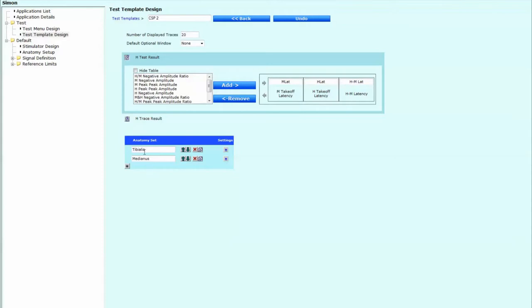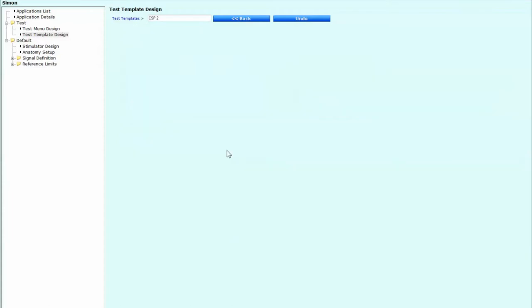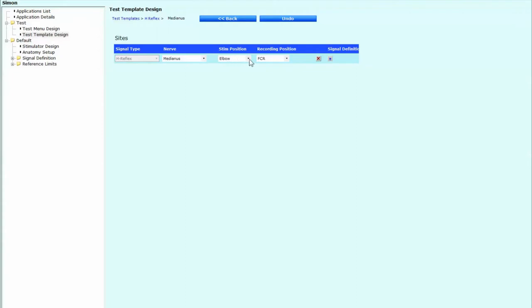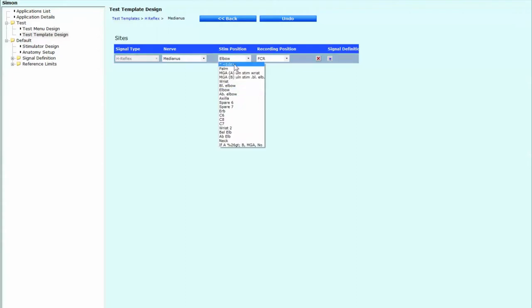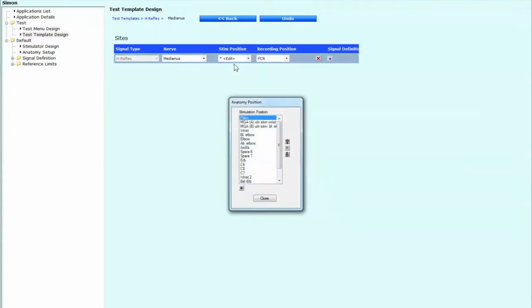The next thing we're going to do is we're going to go to our anatomy set down here. And what we're going to do is we're just going to put in the medianus really. So we're going to just remove tibialis over there. And then we're going to go to the settings. So over here, we've got signal type. That's going to be the H-reflex. The nerve is going to be the median nerve stimulating position.